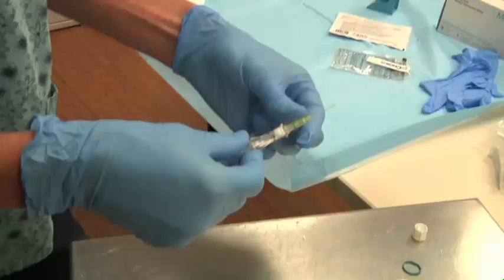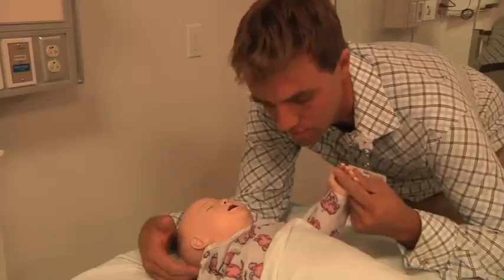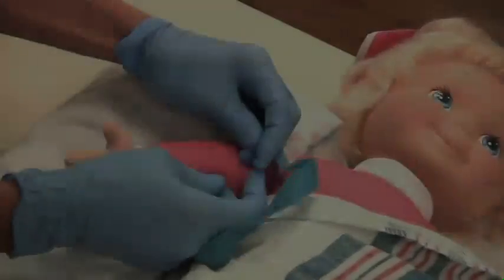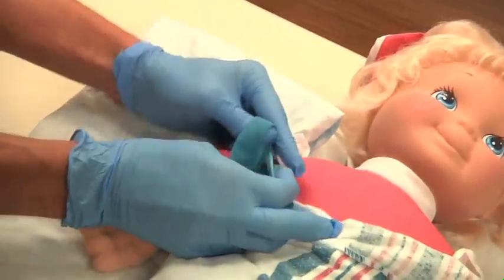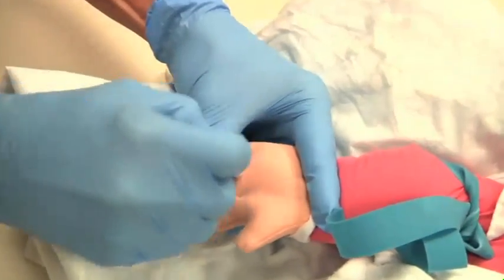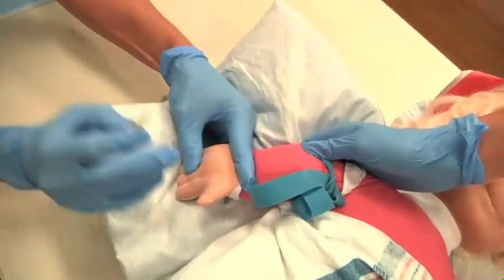For optimal results, have child life specialists present, make sure the patient is in a comfortable position, and have extra holding help available. Apply the tourniquet. Cleanse the insertion site with antiseptic and allow it to dry completely. Stabilize the vein by applying pressure and stretching the skin.